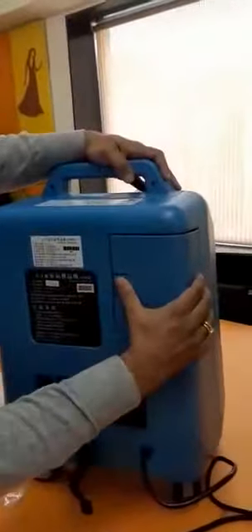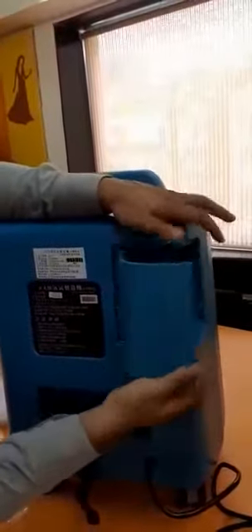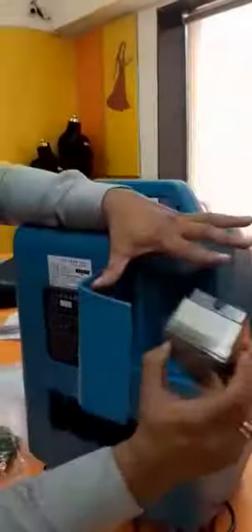So this is the filter — you have to pull it out like this; it is not fixed, just loosely arranged. This is the oxygen filter, which prevents dust and any kind of microbes from entering the system. The life of the filter is 5000 hours, and once it is over, you need to replace it.